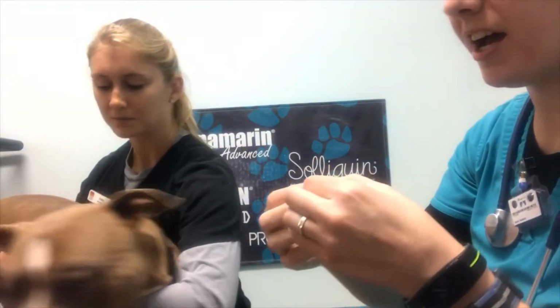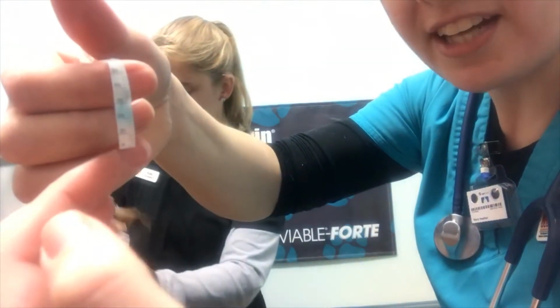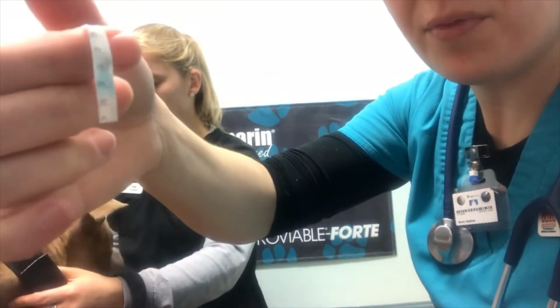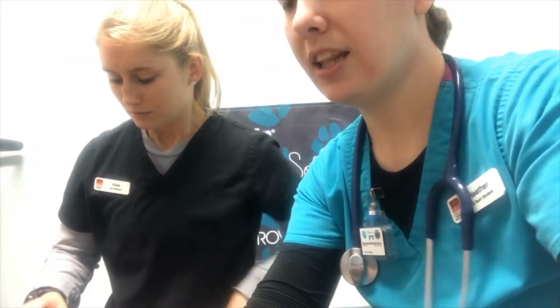So his right eye came in at 26. There you can see how it kind of turned blue as it went down. That is how it measures the tear production. So now we'll move on to his left eye.